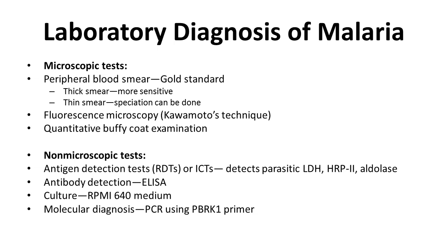The other thing is that for species identification we should know the morphology of the RBC. We already discussed this. In the case of Plasmodium vivax, the RBC morphology is enlarged and pale in color. In the case of Plasmodium ovale, the RBC is enlarged, oval shaped, sometimes fimbriated.